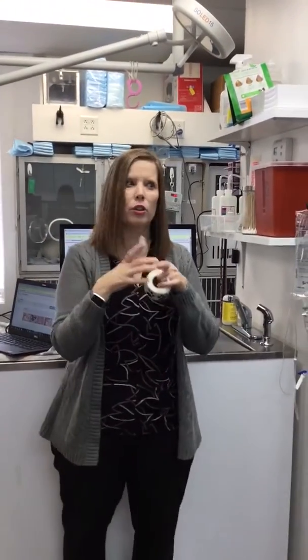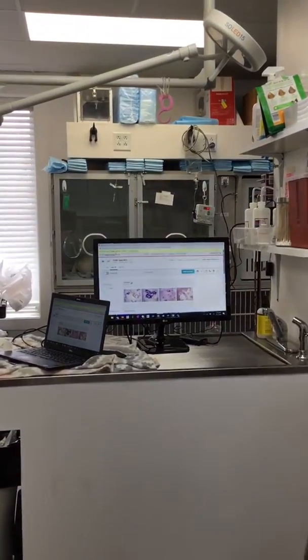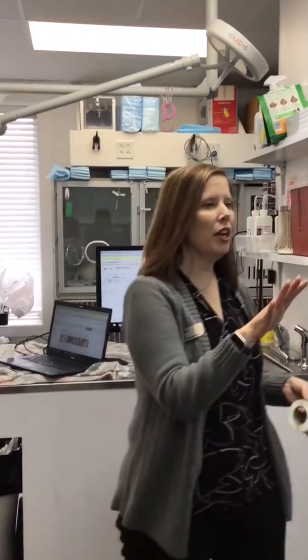How long is that whole blood separator good for that you need to run it? After you fill it, before it needs to be spun down in the analyzer. And this is actually for any green top testing. Is it 2 hours? No. Is it 15 minutes? 20 minutes? 30 minutes? 30. Okay, yep. All right. Way over. So 30, and here's why.